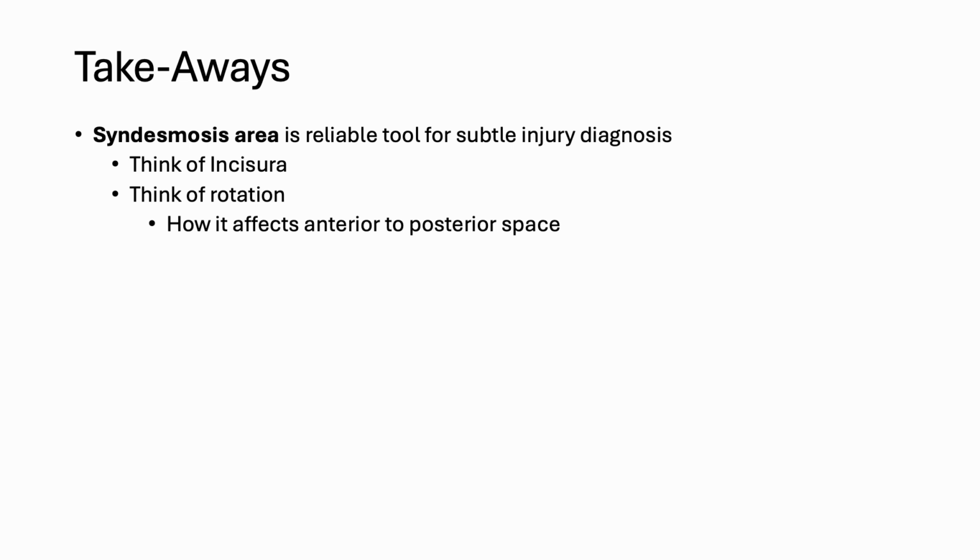I should have thrown this in this study, an example of a 20-year-old, her foot, showing that we didn't fix an isolated fibular fracture based on her preference, but basically a year after her injury, she already had lateral gutter impingement, lateral gutter arthritis, because we didn't fix the fibular rotation. And it's really eye-opening once you read these studies on weight-bearing CT scans and these subtle syndesmotic injuries.